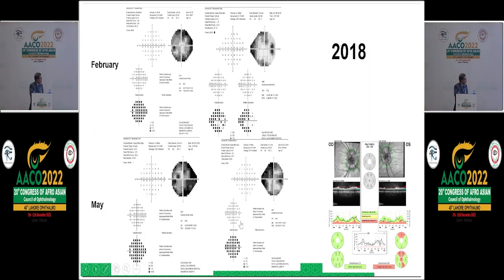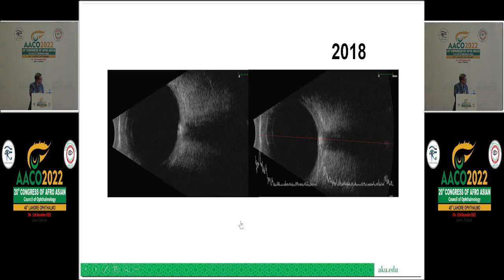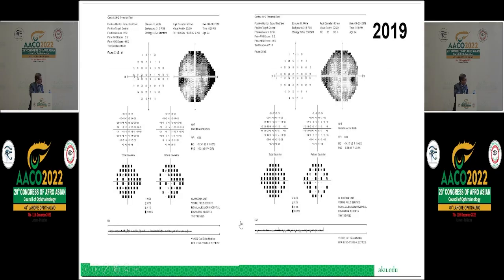And when we did the visual fields, we were kind of surprised that the fields look quite a bit worse, right? You're starting to get overall depression, maybe nasal more than temporal, and even in this eye, some diffuse depression. This does not look like necessarily glaucoma or typical idiopathic intracranial hypertension, etc. So there's something strange about this particular field as well. We did the ultrasound, which also shows enhancement, suggesting possibly drusen.